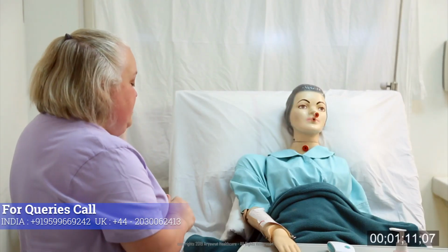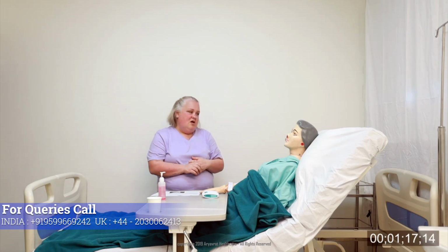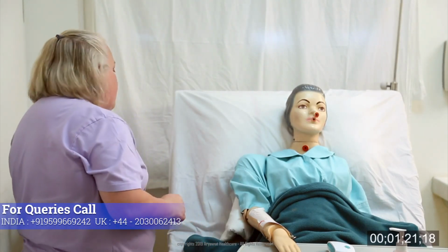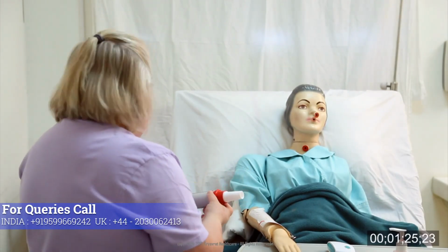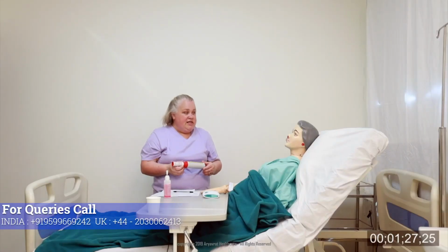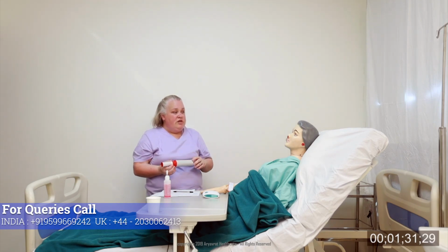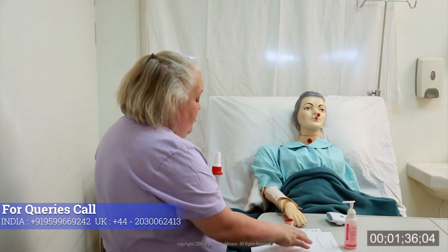Yes. So one of the reasons that I've come here this afternoon is to demonstrate the peak flow meter with you. Have you seen one of those before? I've just seen it, but have not used it. You've not used one of these. So this is one of the peak flows. It's going to take about 10 minutes to do this. Is now a convenient time? Yes. You don't need to use a washroom or anything before we start? No, I'm fine.